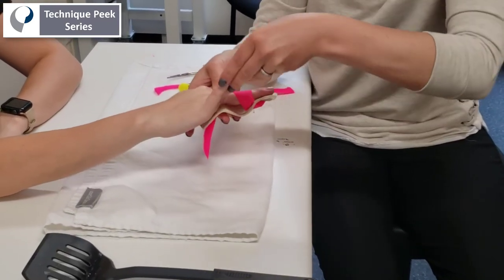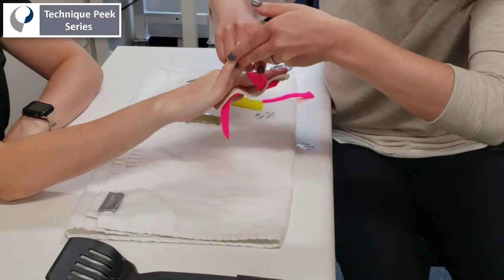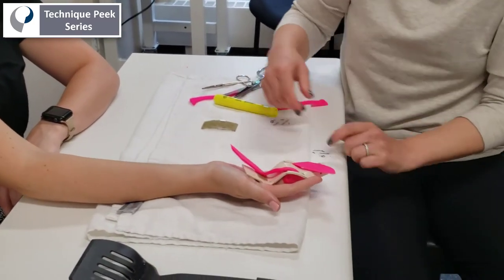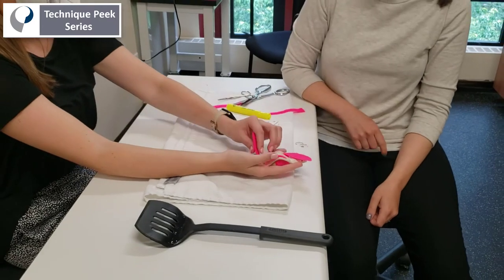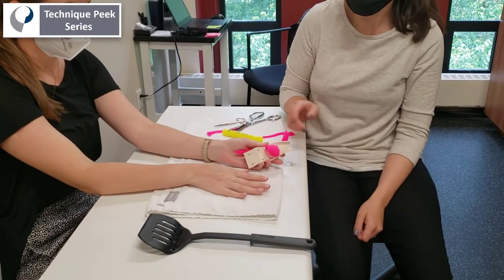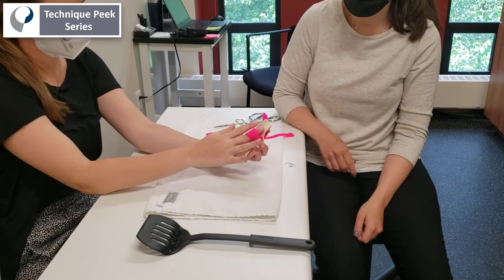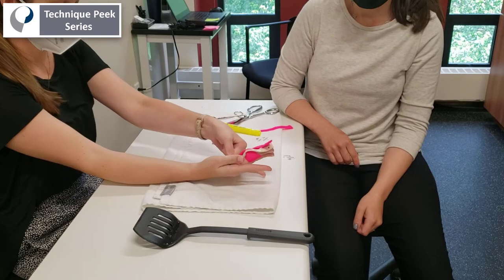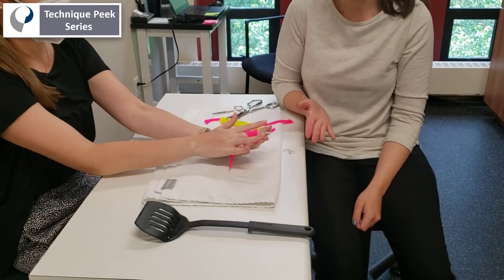Now you're going to want to check the position of the splint and have the patient sit there for a few minutes in the clinic to make sure there's no signs of decreased circulation or irritation from the splint. You can see here that the patient is able to get in and out of this splint using just one hand to tighten the strap, because they leave either the distal or the proximal strap affixed at all times.